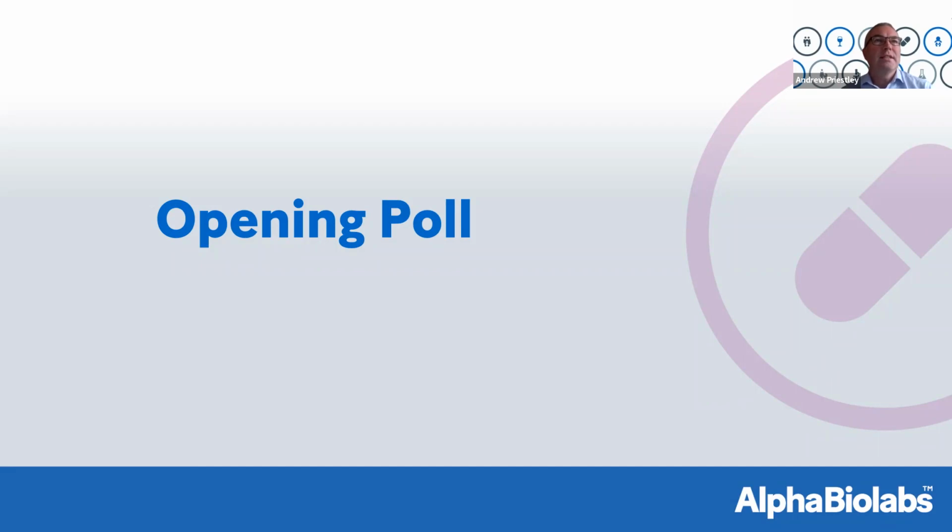Okay, so the question is, how many days after the use of a drug will it first be detected in a sample of head hair? I'm going to share the results with you. So, an interesting set of results there. The most popular response was 3 to 5 days: 53% of you think it's 3 to 5 days. 16% said instantly, 16% also said 1 week, and 15% said 2 weeks. Well, the correct answer is the 15% of you that said 2 weeks. So two weeks is the answer there.